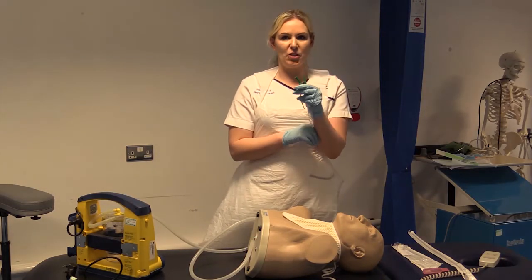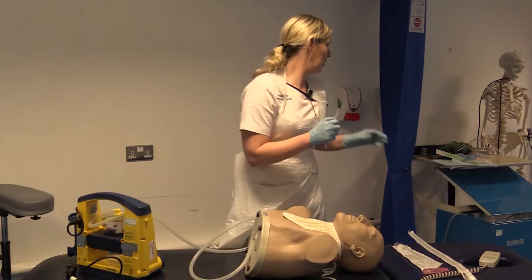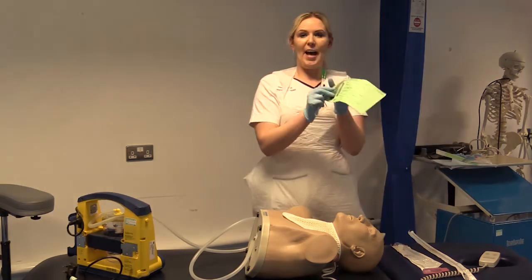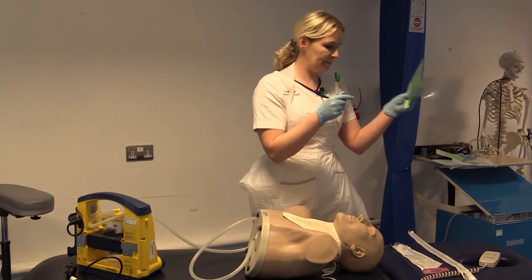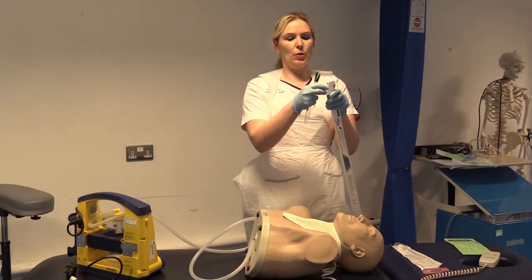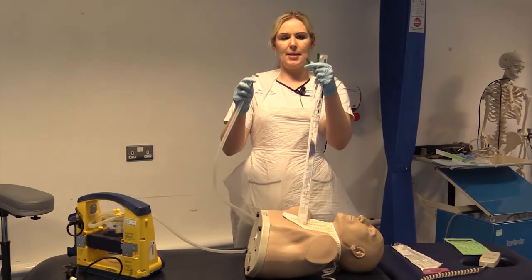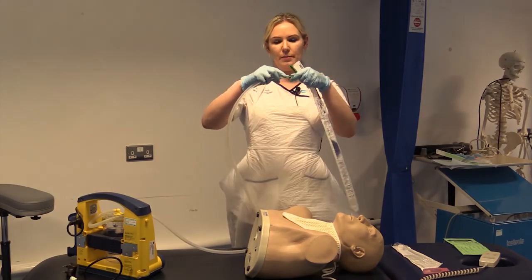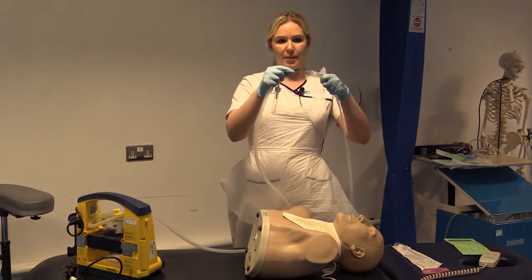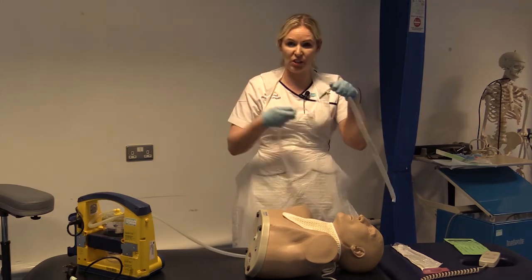So when you go into the patient's room, make sure you have all your necessary bits and pieces with you, including your sputum trap, your request form, your biohazard label, and any patient labels that you need to take in. Okay, so really there's only one way that this can go. This end attaches into your suction tubing, okay, and this part goes to your catheter. Okay, and then you just proceed on with your normal suction.